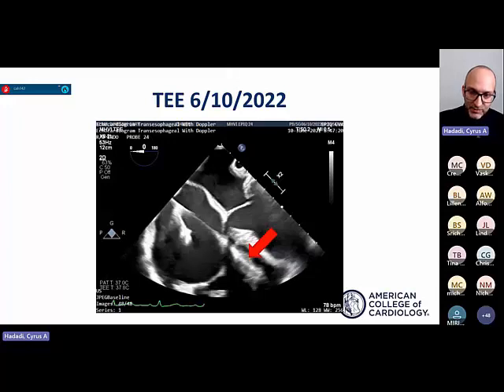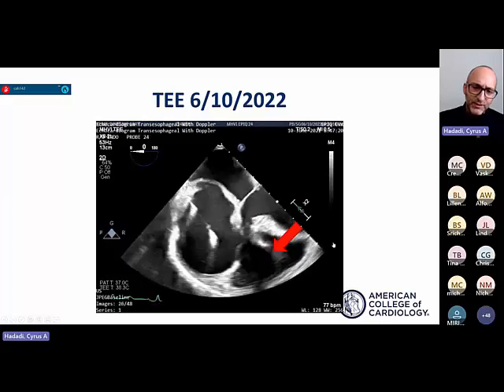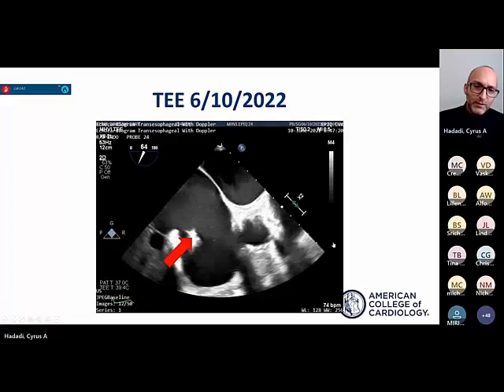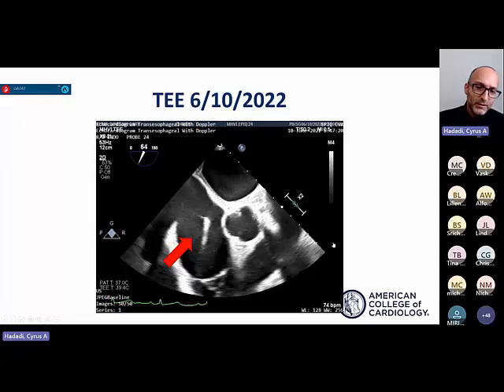You have a very positive arrow sign here, pointing to very extensive echodense material on the RV aspect of the device lead. Here's a slightly different view, but again, just thick echodense material there. Again, the challenge is going to be: is this thrombus, infection, or infected thrombus? You can also see that there are independent echo densities here on the atrial lead as well.